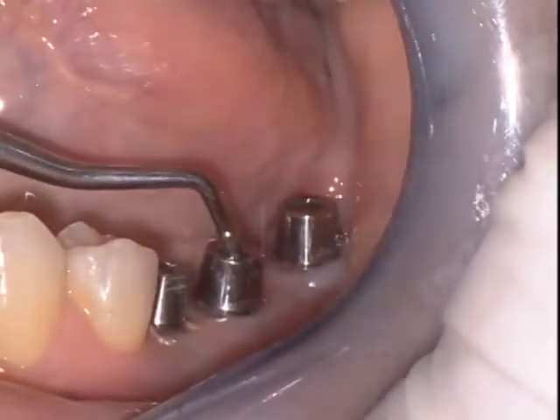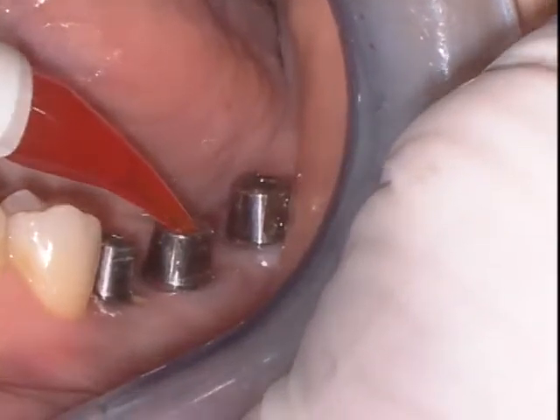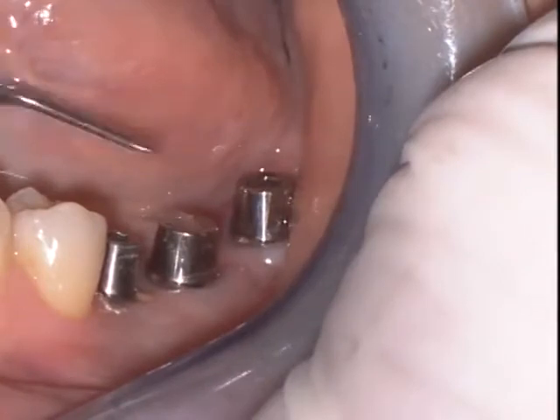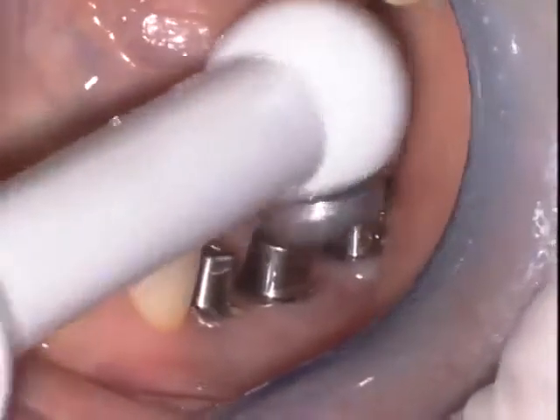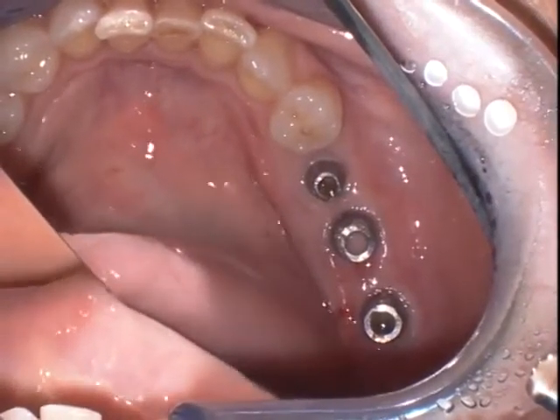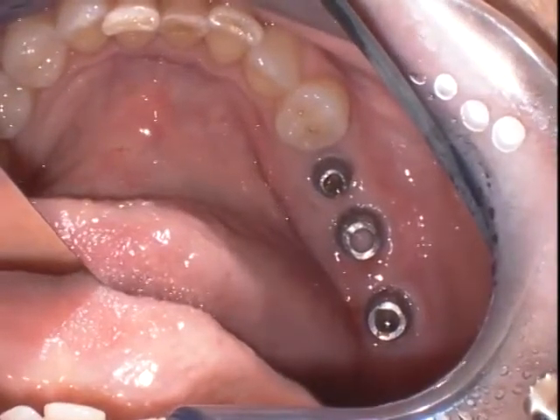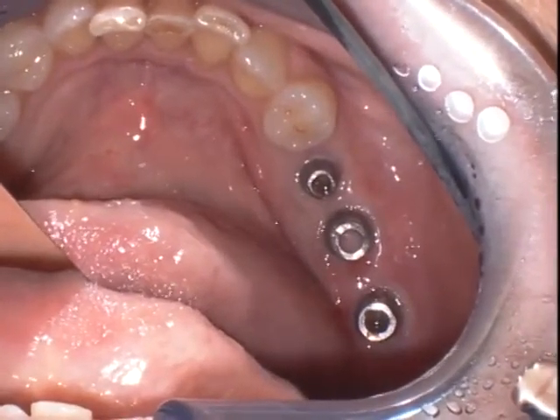Silicone is then placed. That's the preference for us over barricade for final restorations. And that also allows us to maintain a covered and protected screw access channel. Again, barricade is going to be placed on top of the silicone to seal off that space. Look at the healing on the posterior after only 2 months. Beautiful healing with keratinized tissue on both the buccal and lingual aspects.